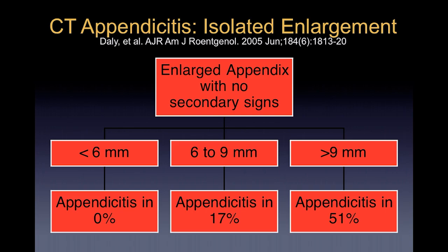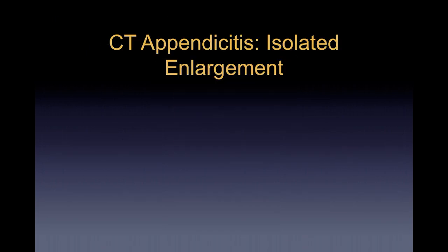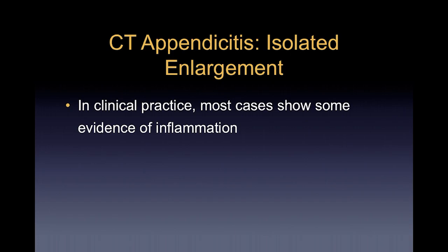It's a 50-50 chance of appendicitis when you see those findings. In the middle, a little bit hard. There's some incidence of appendicitis, but less likely. So that's a bit tough. It's hard to make a definitive diagnosis when you're telling the surgeons it's a 50-50 chance of appendicitis.